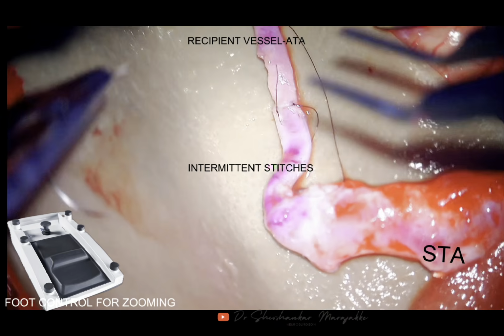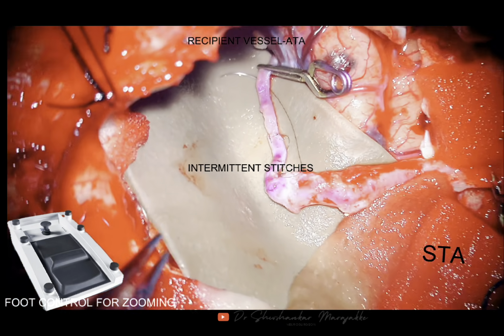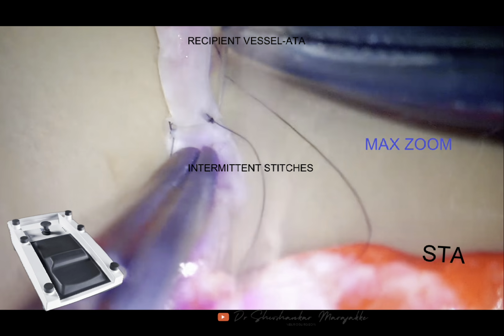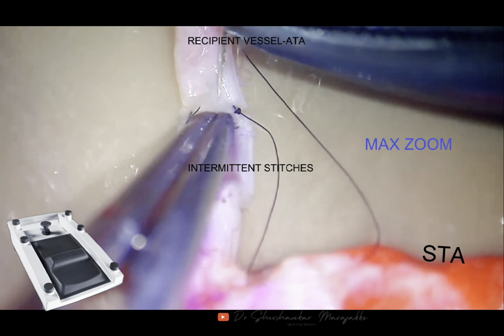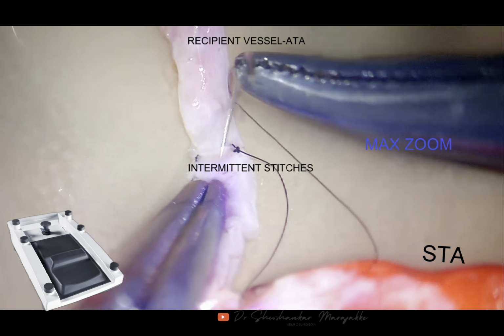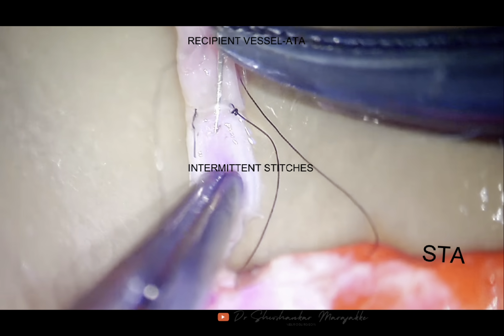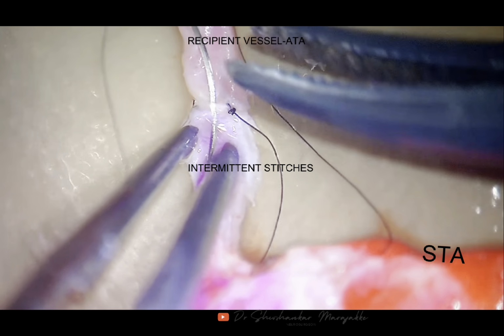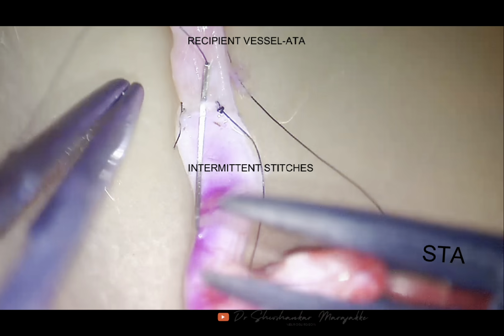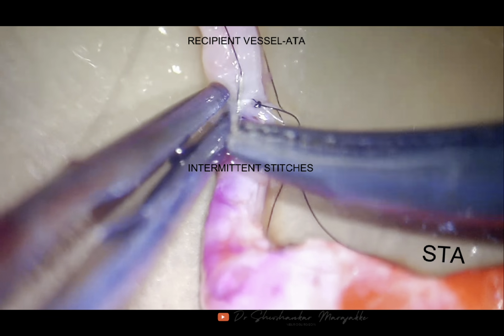So afferent and efferent arteries are sectioned transversely, as we have seen here, and the aneurysm is excised and completely separated, and the vessel is brought up into the field. You can see that I have put two sutures at 12 o'clock and 6 o'clock, and I am suturing on the dorsal surface. I have marked the dorsal surface with the marker so that the vessels are not rotated and will not kink.